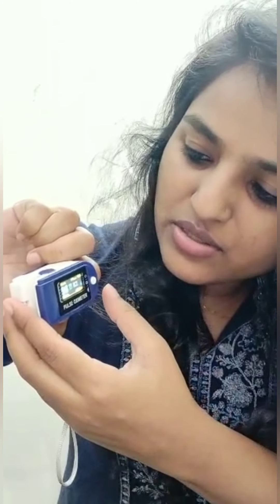It has become 97 and 76. Now 98. After removing your finger, it is showing finger out.